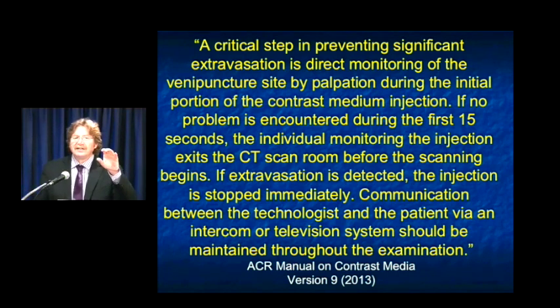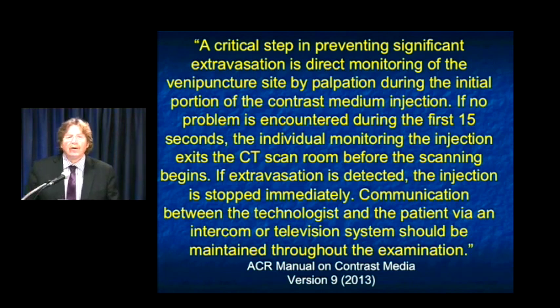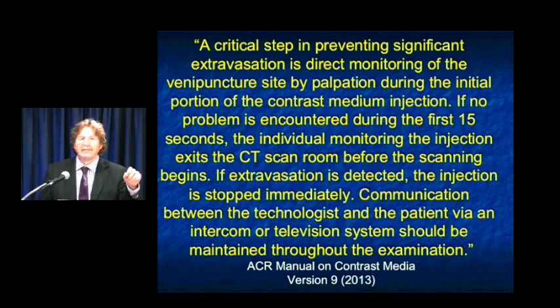It's rare for the injection extravasation to occur the last 20 cc's. It's not like 80 cc's goes in well and 20 extravs. That's pretty rare. What usually happens is 5 cc's go in, then you have extravasation. Now, in most of our cases, we're scanning at 30 seconds. So the tech stays in the room. They could be in the room for most of the injection, having their hand at the injection site, making sure there are no issues. And that is the way to do things.